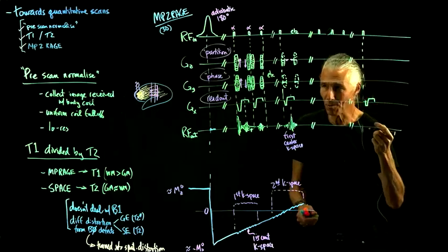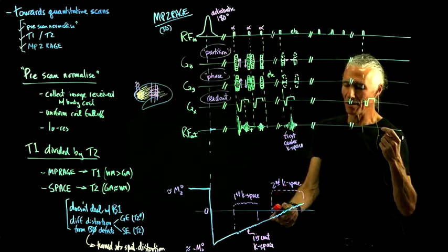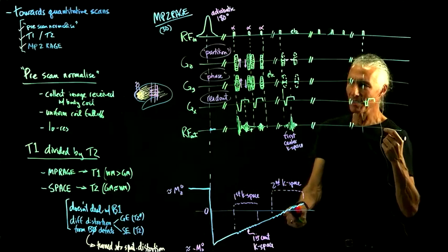In this one, we want the gray matter to have recovered to 0 and the white matter to have recovered above 0.